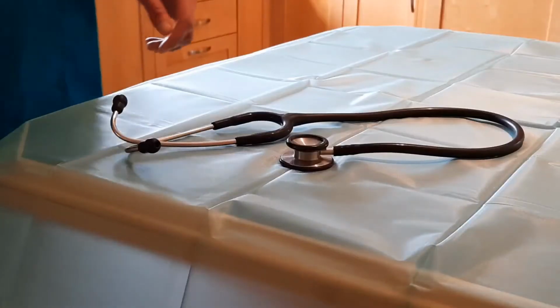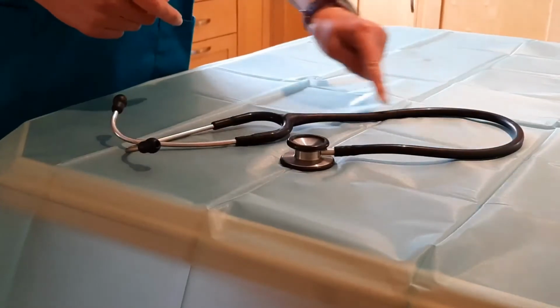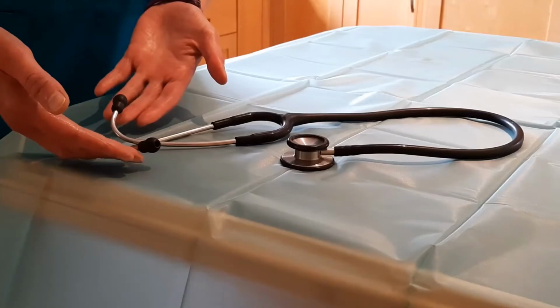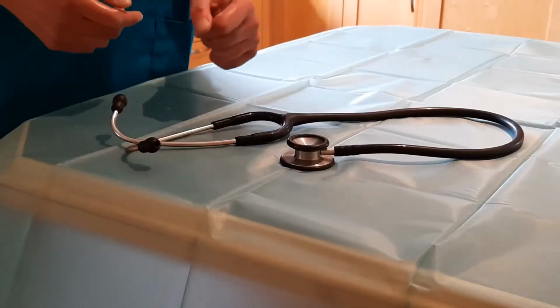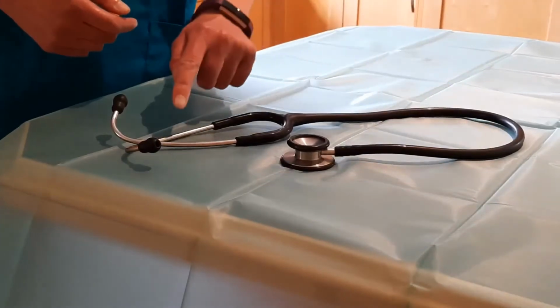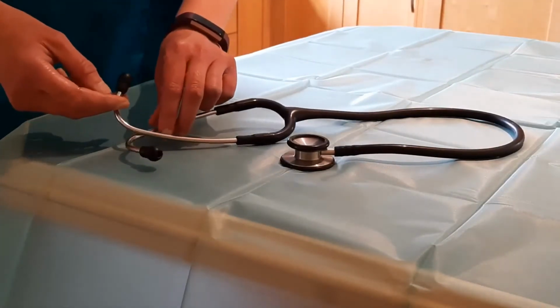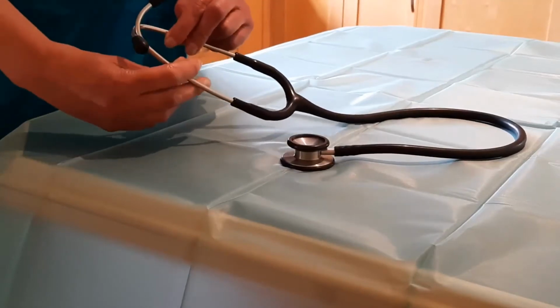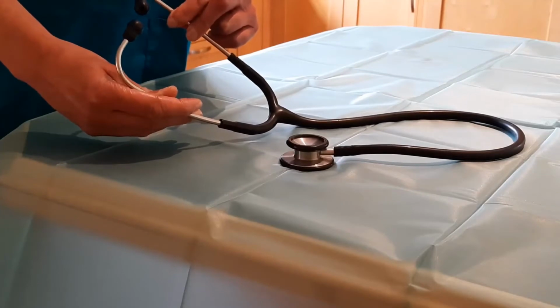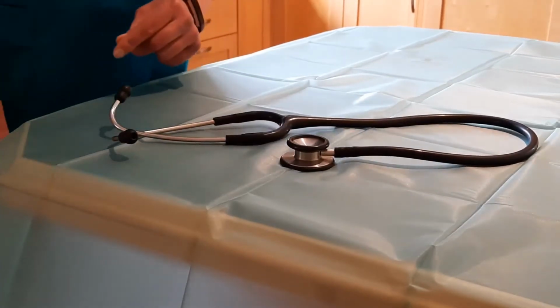This is a stethoscope. It consists of a chest piece, a length of tubing, 2 binaurals and 2 earpieces. The chest piece is positioned against the patient and sound then travels along through the tubing and the binaurals and into your ears. When you fit the stethoscope, it's important to place the earpieces facing forward into your ear canals, because that means that sound will be transmitted most effectively.